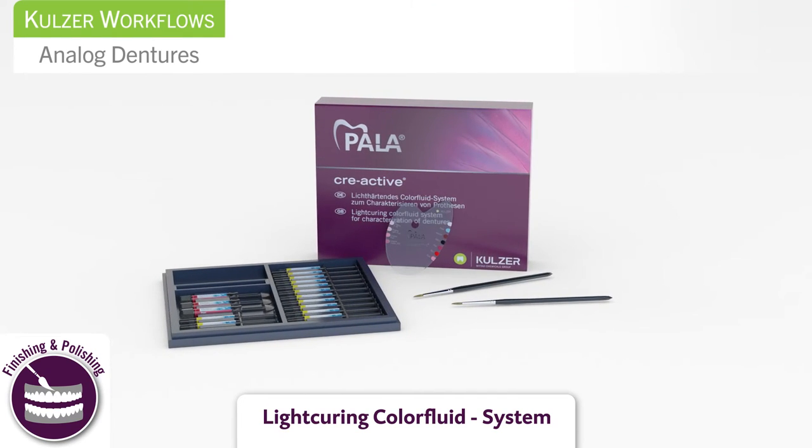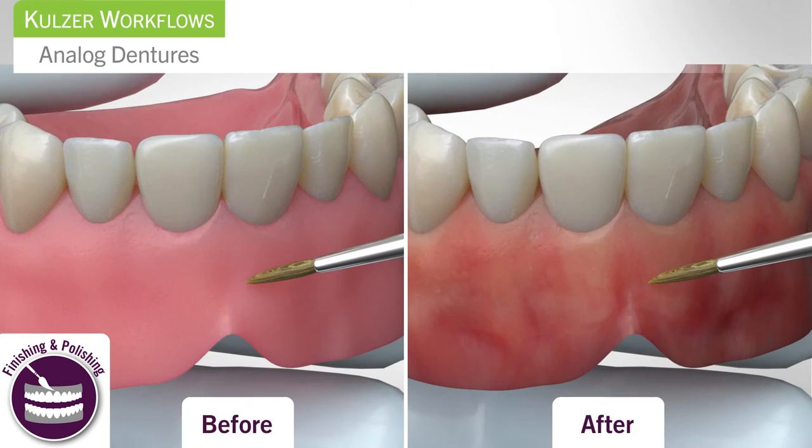To create beautifully individualized dentures, use PALA cre-active, a universal light curing color fluid system. PALA cre-active makes gingival customization fast and easy.